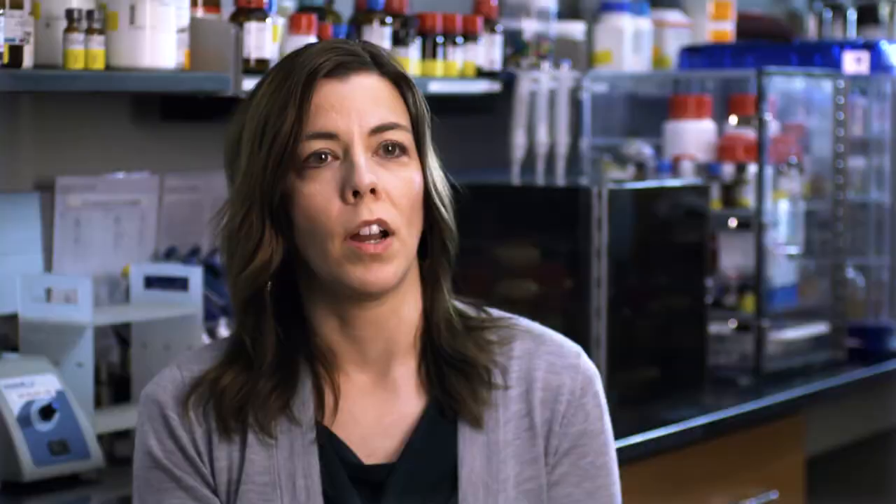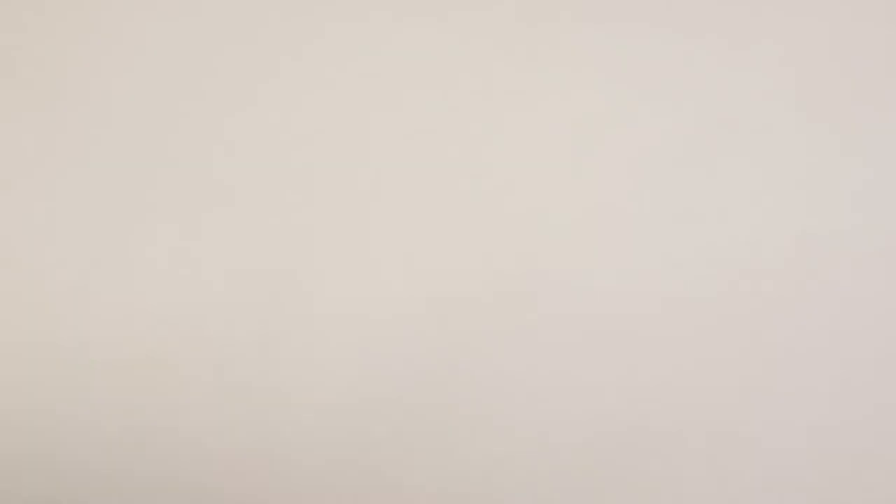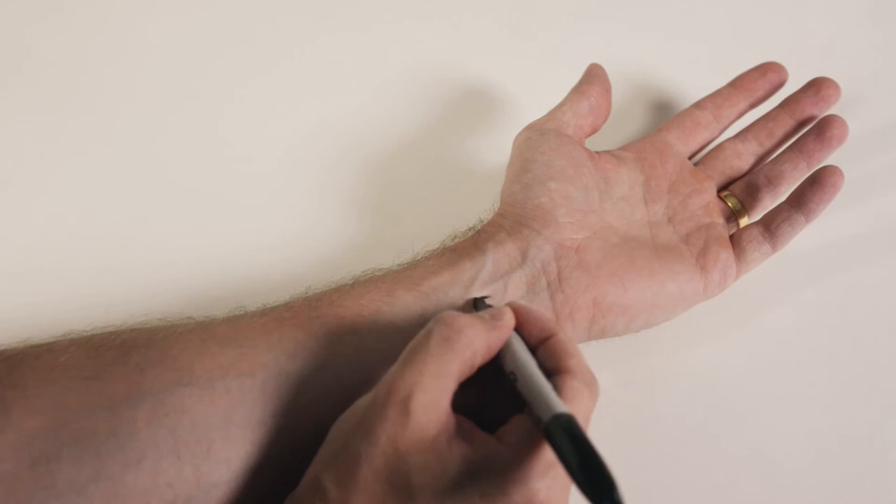It's going to potentially enable a diabetic to have continuous glucose monitoring. The sensor that we're trying to develop — we envision that it would be placed in the skin just below the wrist, and this device would be complemented with something that looks like a watch.